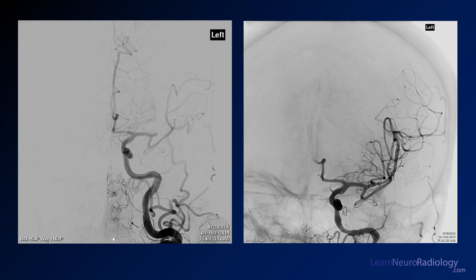Here we have some images from an angiogram — a frontal angiogram. You have the internal carotid artery coming up, bifurcating into the left ACA and left MCA. And here, out of the distal M1 segment, you have a truncation — an occlusion of an M1 branch there right in the sylvian fissure.